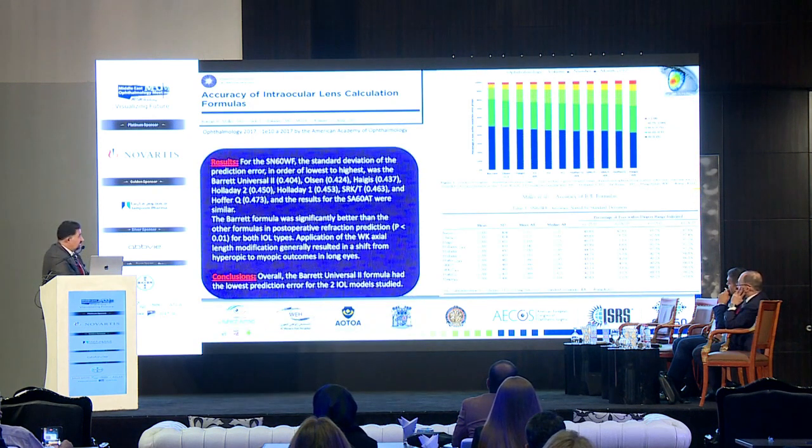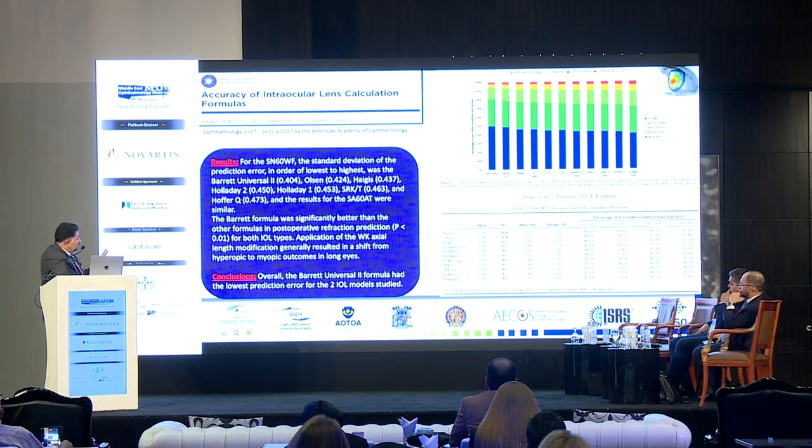So this is a very nice study presented at the American Academy in 2017, using different formulas and using the IQ IOL from Alcon. They calculated that overall, the Barrett Universal II formula had the lowest prediction error for the 2 IOLs they were using, comparing all the different formulas in this study.